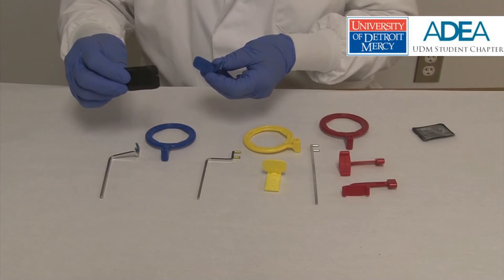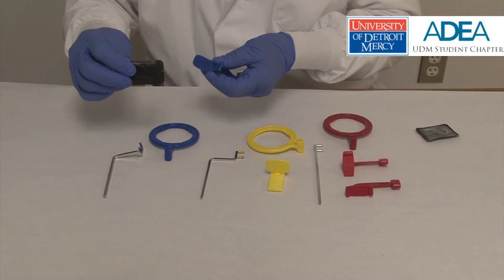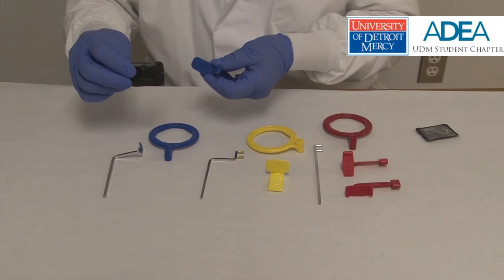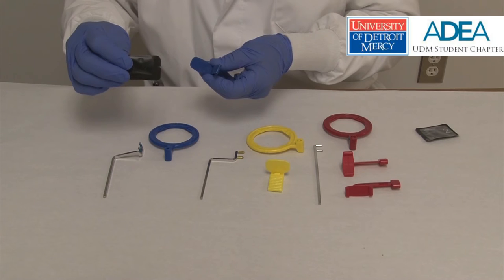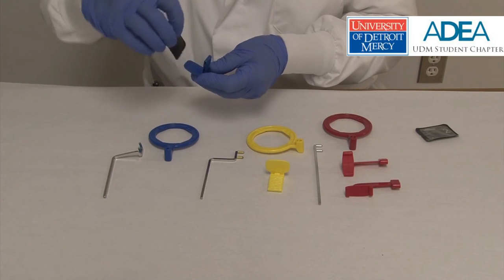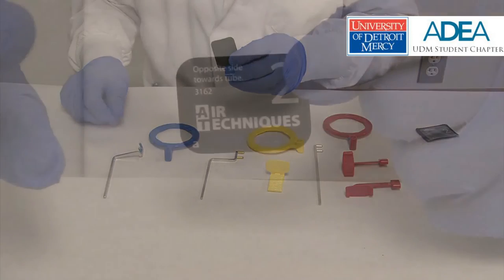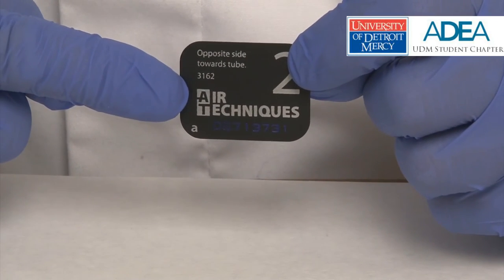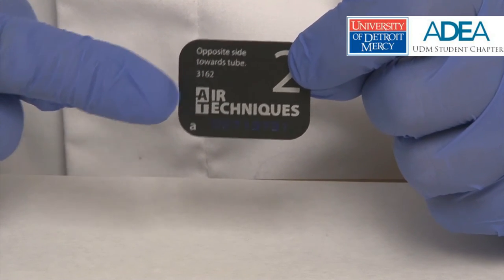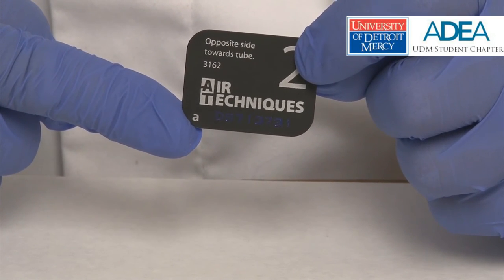The sensor plate is aligned in the XCP holder so that the image side is exposed to the X-ray beam for both anterior and posterior periapical images. The black side of the sleeve is fully visible, and the logo side is placed against the holder upright. Of all the printing on the logo side of the sensor, only the manufacturer's mark, the letter A, will be superimposed on the image.